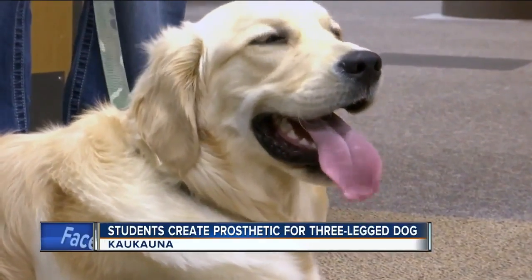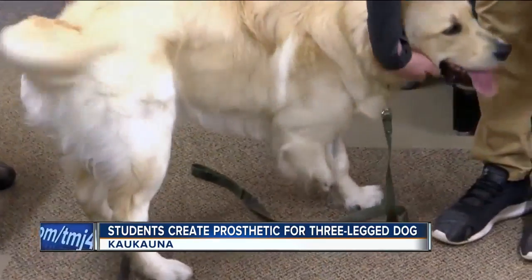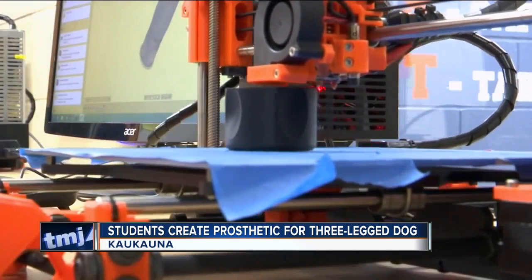One Wisconsin high school is coming together to help a dog with three legs. Students in Kaukauna are using a high-tech 3D printer to make a prosthetic limb for the puppy. Filled with energy and smiles, Gray, an 11-month-old golden retriever, is like a normal pup in every way but one — Gray has three legs, but is about to enter the four-legged world thanks to a high school engineering class in Kaukauna.